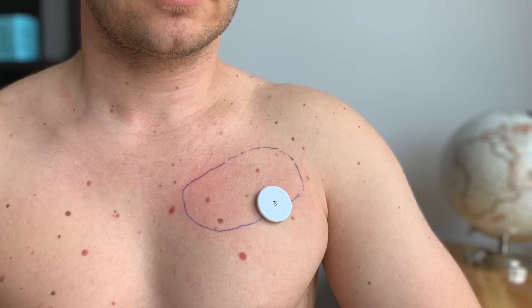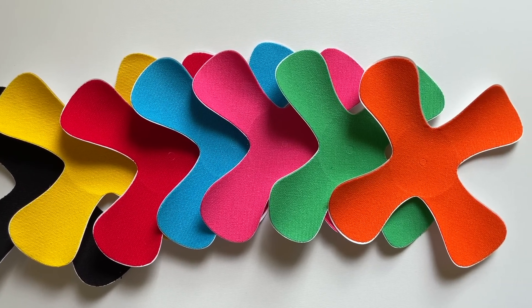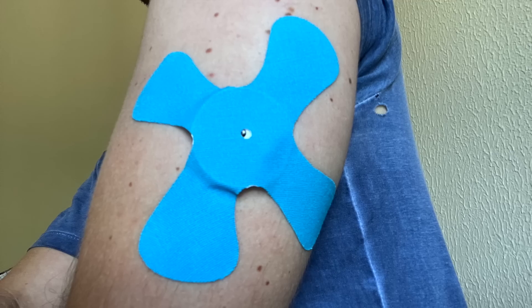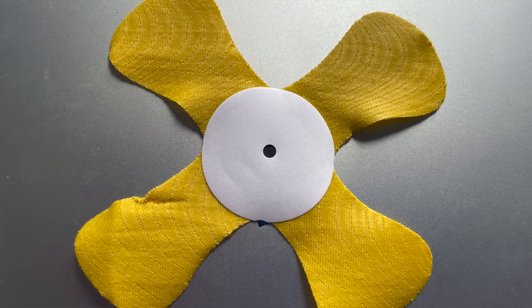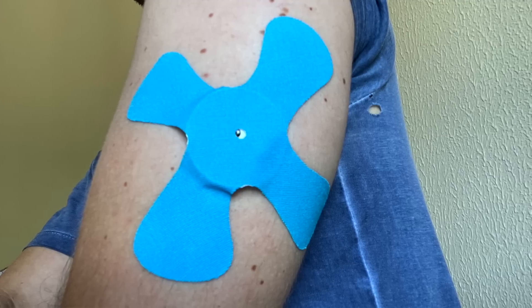Another reason why many Freestyle Libre users give up is that their skin doesn't cooperate with the sensor adhesive. If your sensor doesn't stick well, first find a flat spot well protected from objects that could tear it off — often the backside or inner side of the arm rather than the outer side. Second, apply Libre on perfectly clean, dry skin: clean with alcohol and let it dry at least a minute. Third, use extra adhesive patches — I recently discovered colorful X-shaped patches with a non-sticky area in the middle placed over the sensor, so they don't stick to it and are easy to remove without pulling the sensor out. They even have a tiny hole in the middle so the patch doesn't cover the Libre sensor's humidity and temperature regulation hole.